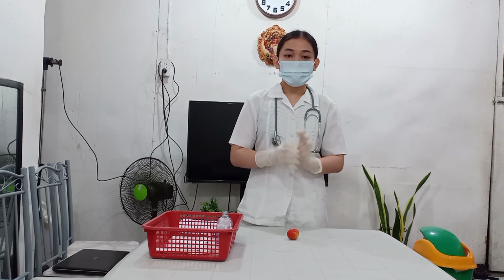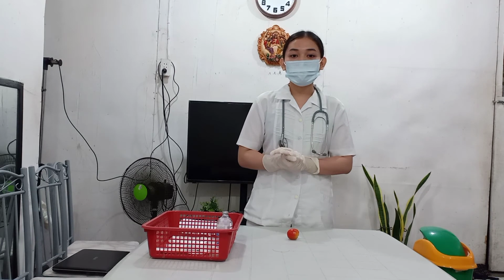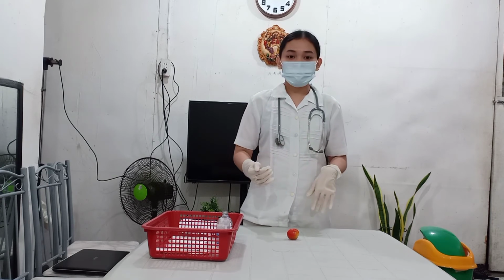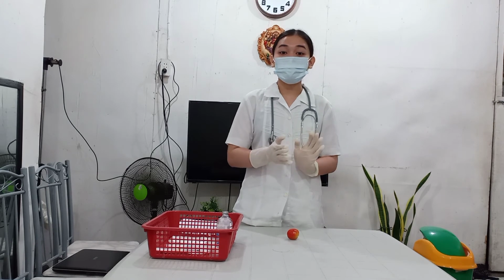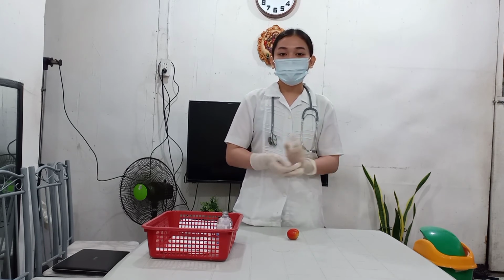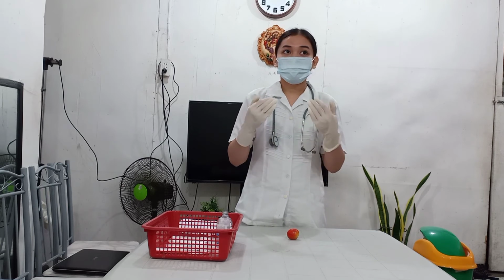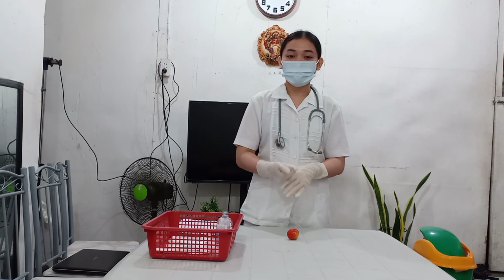Now, we locate the exact site for injection. Correct site identification decreases the risk of injury. Also, good visualization is necessary to establish the correct location of the site and avoid damage to tissues. So, assuming that I've decided to select the deltoid site.